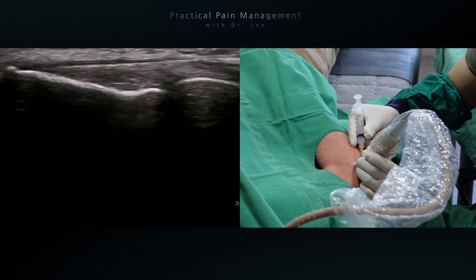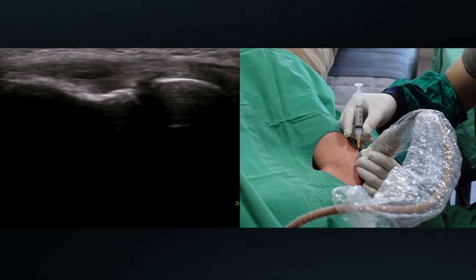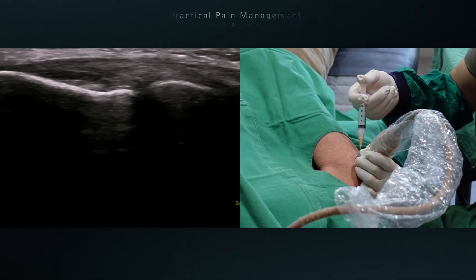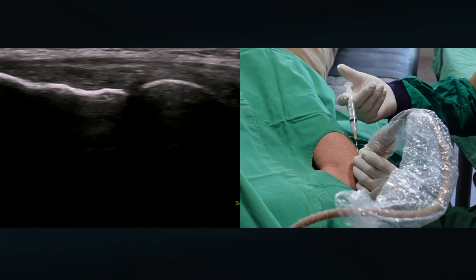I am peppering the solution into the tendon. The peppering technique is sometimes used to inject autologous blood. This involves inserting the needle into the tendon, injecting some of the solution, withdrawing without emerging from the skin, then slightly redirecting and reinserting.